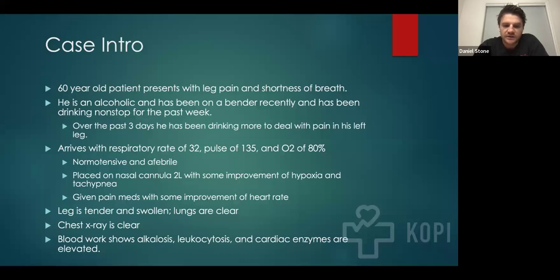The blood work eventually showed alkalosis, leukocytosis, and the cardiac enzymes were slightly elevated. This case draws a little bit of focus on how cross-sectional imaging can be used, and we'll talk a little bit about that.